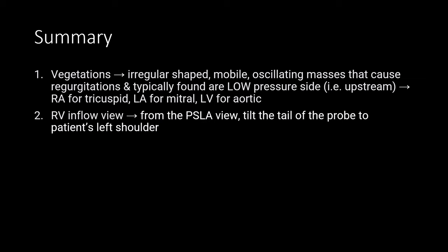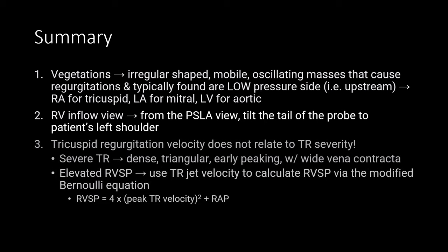The RV inflow view is important. From the parasternal long axis view, tilt the tail of the probe to the patient's left shoulder to bring out the RV inflow. Finally, tricuspid regurgitation velocity does not relate to TR severity. If you have severe tricuspid regurgitation, you'll notice the Doppler signal is dense, triangular, and early peaking, with a wide vena contracta. Whereas if you have elevated right ventricular systolic pressure, you'll use the maximum velocity of the TR jet to calculate the RVSP using the modified Bernoulli equation, which we will discuss in a future case.